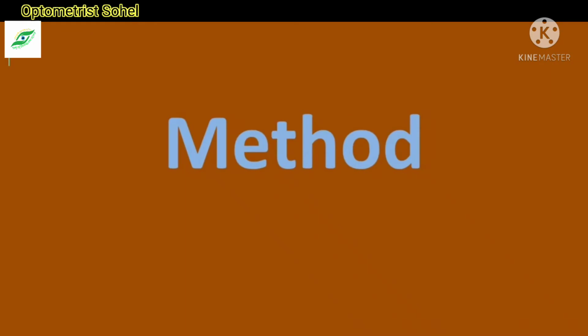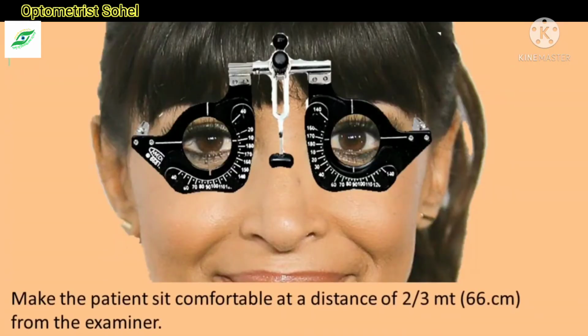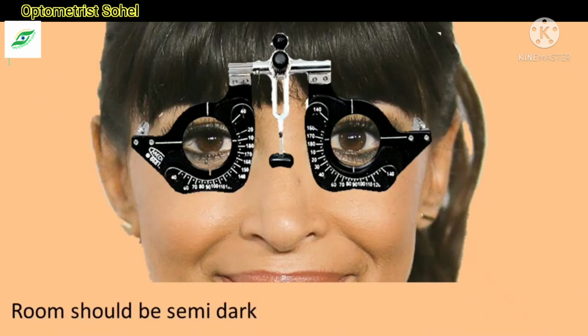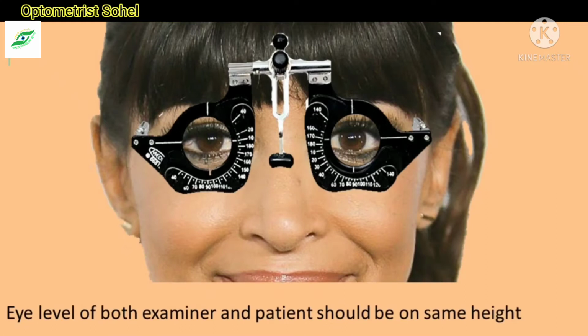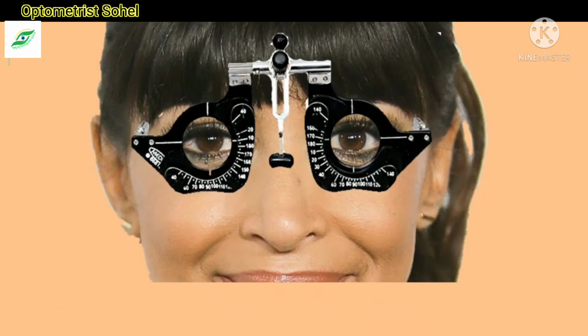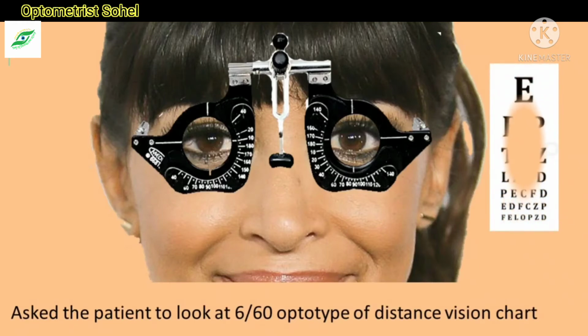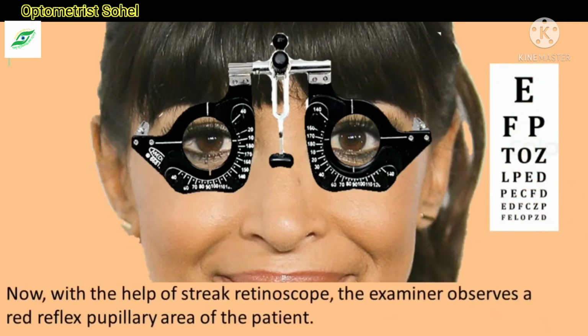Method: Make the patient sit comfortably at a distance of 66 cm from the examiner. You can also use a working distance of 1 meter or 50 cm. Room should be semi-dark. Eye level of both examiner and patient should be at the same height. Ask the patient to look at 6/60 of the distance vision chart. Now, with the help of the streak retinoscope, the examiner observes a red reflex in the pupil of the patient.